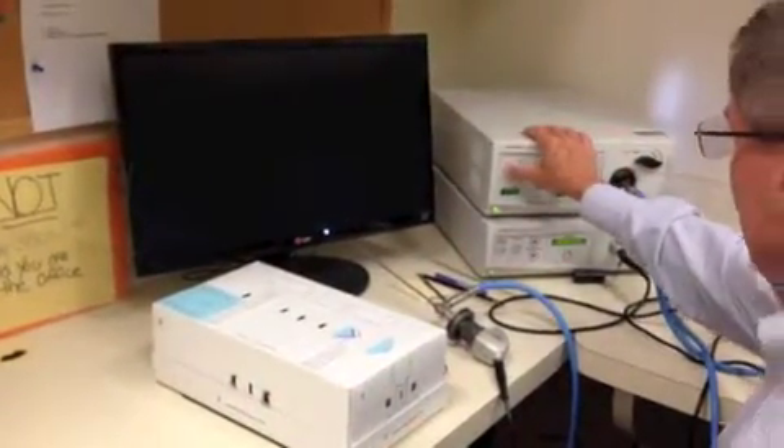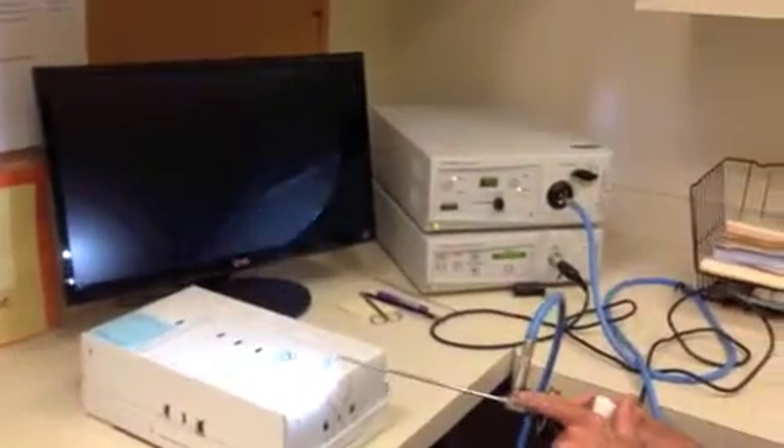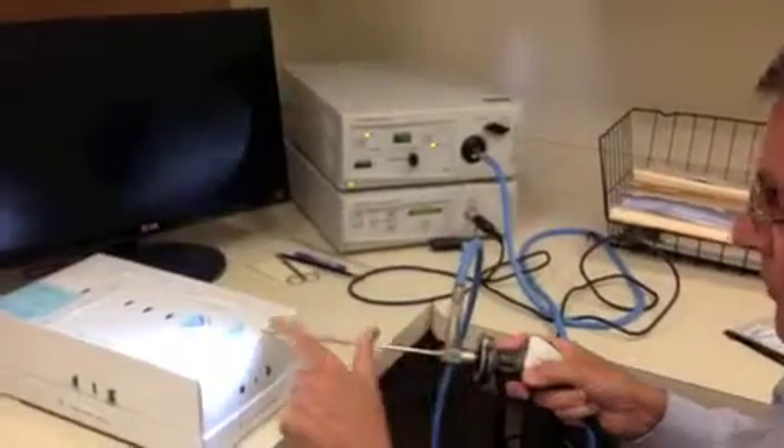We'll now turn the light source on to run. This is hooked up with a fiber optic cable to our scope, which is a 30-degree scope.